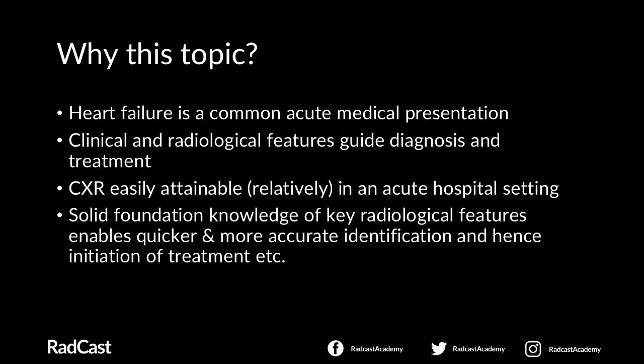Then ideally, to follow on from that, you initiate treatment faster, which leads to better patient outcomes and hopefully patient stabilisation if you have your acute medical emergency. Of course, clinical correlation does come into it as well. So your chest x-ray findings should always be interpreted in tandem with what you're gaining from your clinical examination of the patient.